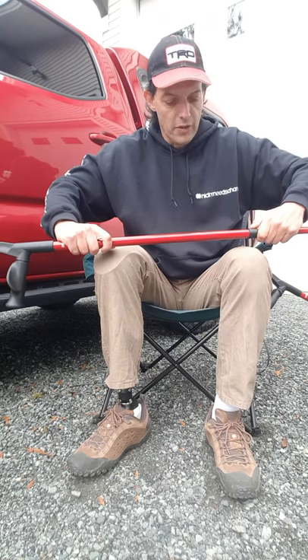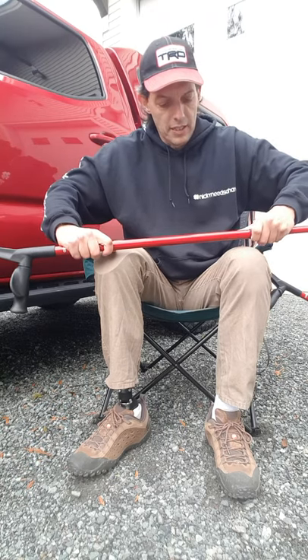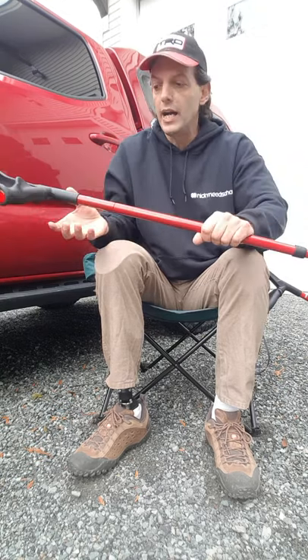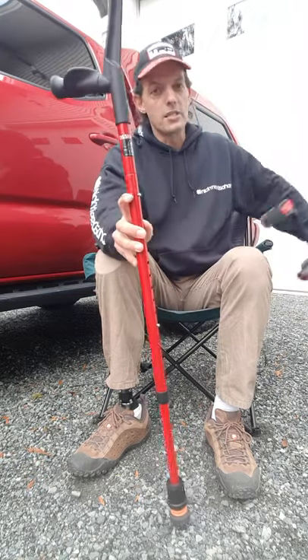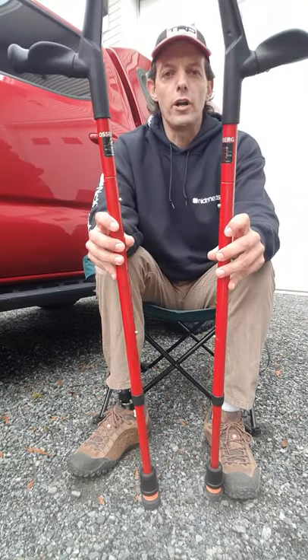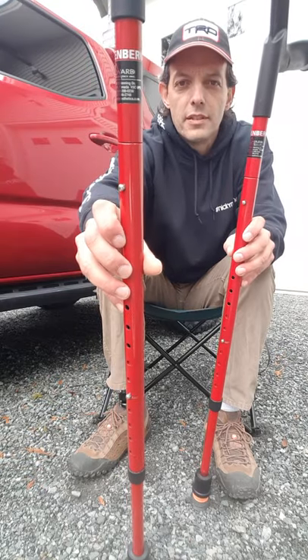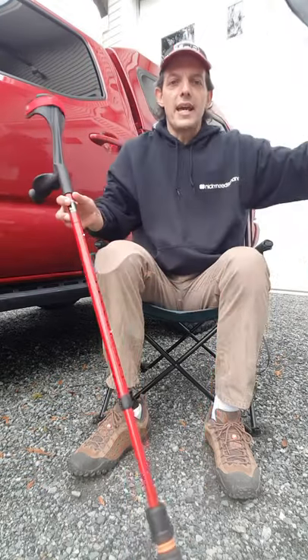I'm going to give them a really good shakedown and I'll keep you posted as to how they perform. They seem to be a really high quality unit — the Ossenberg forearm crutch from Award Prosthetics in Burnaby, BC, Canada. Alright guys, take care.